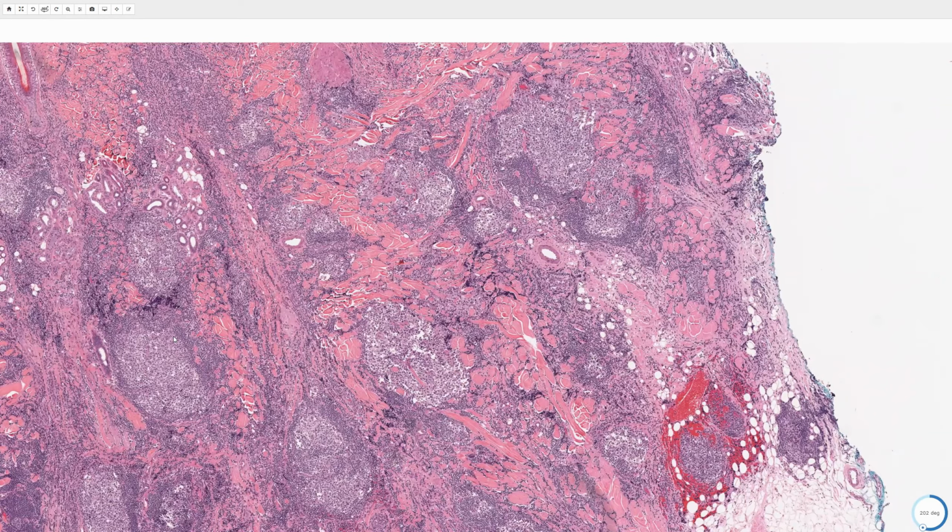So the cells here will be CD20 positive. And then in these germinal center areas, you'll often see a meshwork of CD10 positive cells. The areas that are the neoplastic B cells are going to be CD5 negative, so not marking for a T cell marker. And that's important, especially with the diffuse pattern, if your differential was like a CLL. So CLL will often have aberrant co-expression of T cell and B cell markers. So if you have a diffuse pattern of a follicular lymphoma, it's important to note that this is CD5 negative.